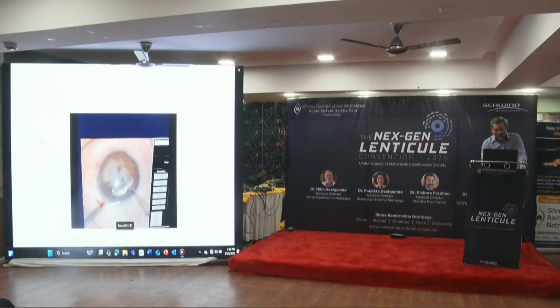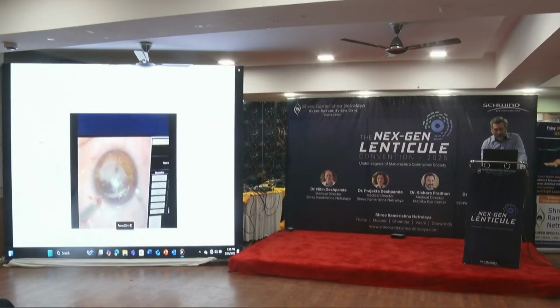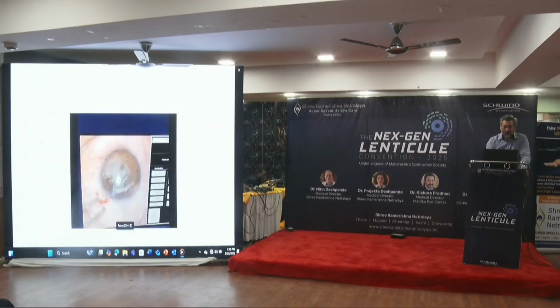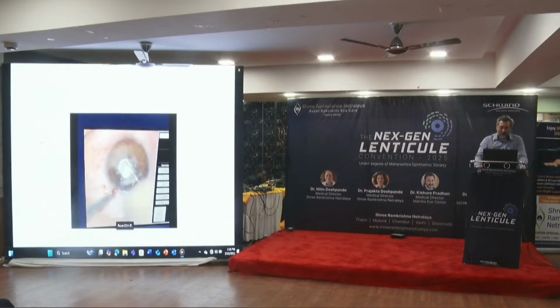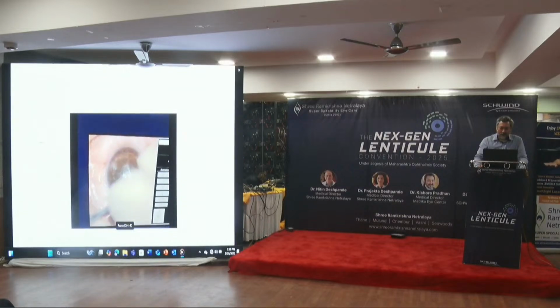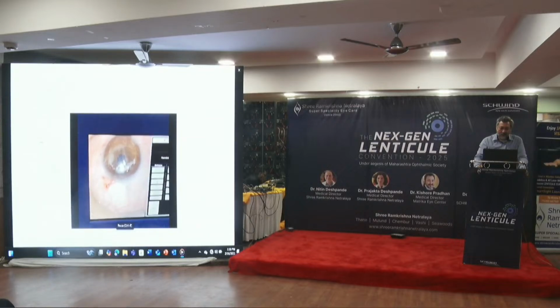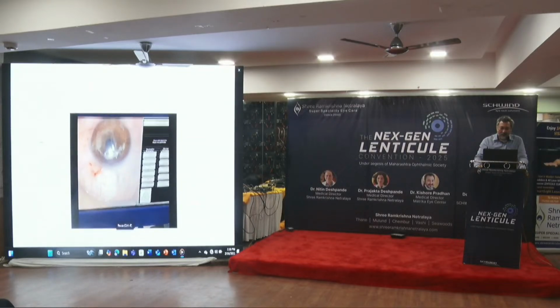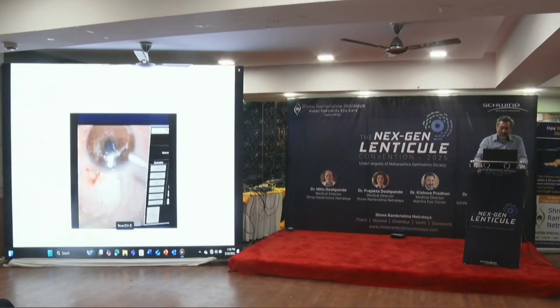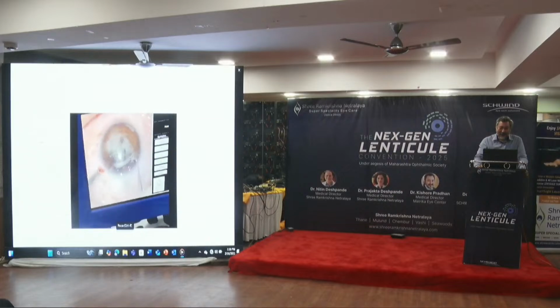And then once you're in the plane, you can go into the different planes, the upper and the lower plane. But this is less than a 2 millimeter incision, so I've used a flap lifter instead of a dissector. The surgery was safely done. See, I always have a retina forceps there to save.